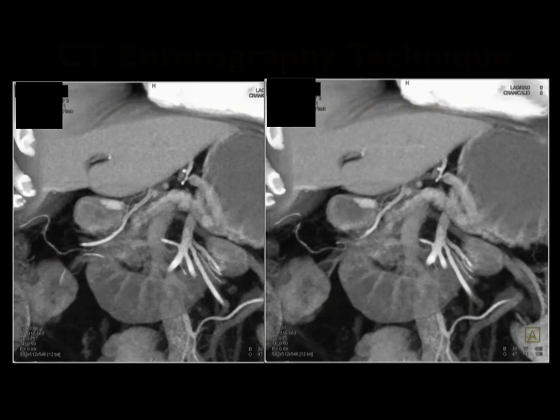But look how obvious it is on the reconstruction views. Here's some more volume rendered images. Again, a vascular lesion, very obvious, but so easy to miss on the axial, because in this case with a flat lesion, the way the lesion was sitting, it was not optimal to look at the axial view. So that's why when we're looking for small bowel tumors, and when I pick up things that I think other people have missed, it's not so much looking at the axials better, but it's looking at the full volume of data.